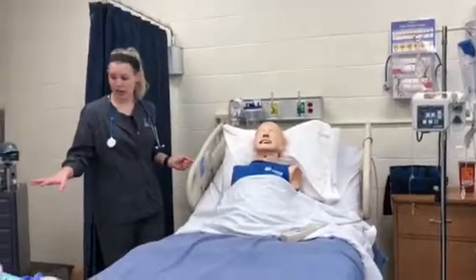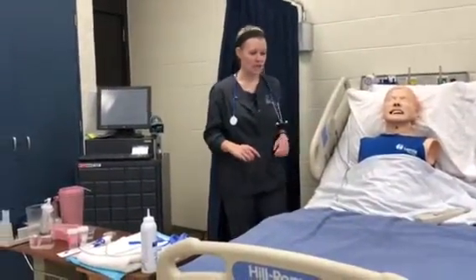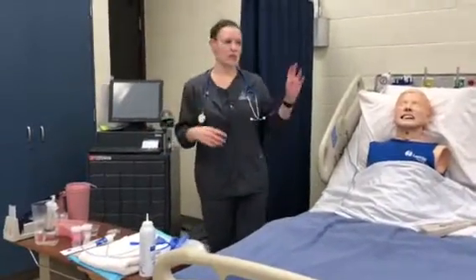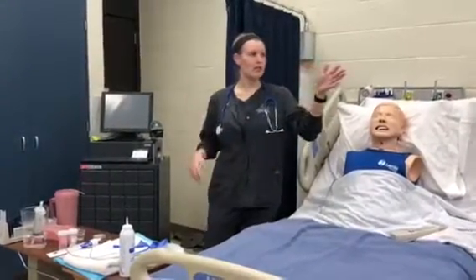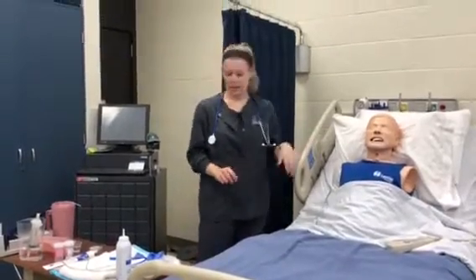I have all my equipment gathered here. I've done my medication checks. I've used my two patient identifiers. To do my medication checks, I've used the MAR, and I've used the electronic medical record in the room with the patient. I've provided privacy. We're in a private room. We have our curtains pulled, and now we're ready to go.